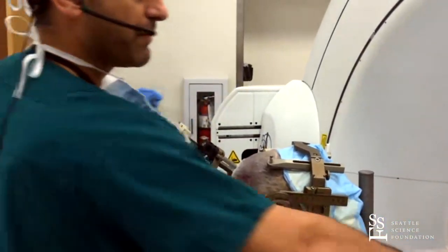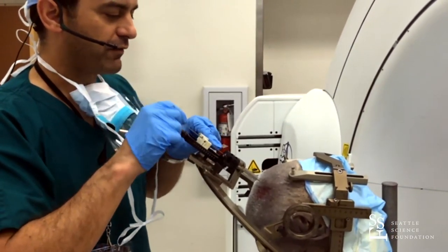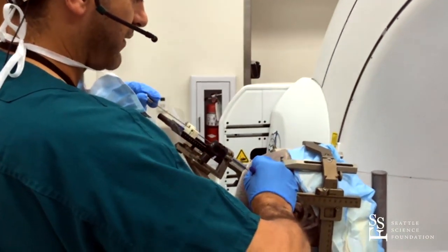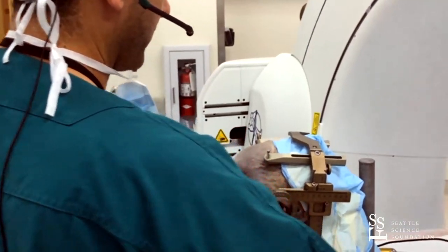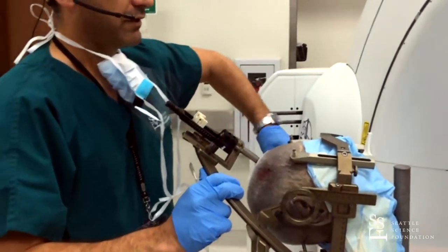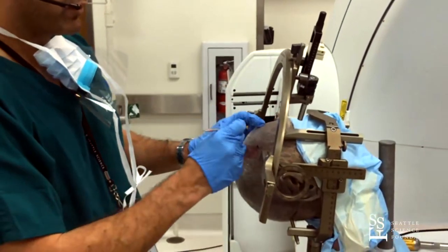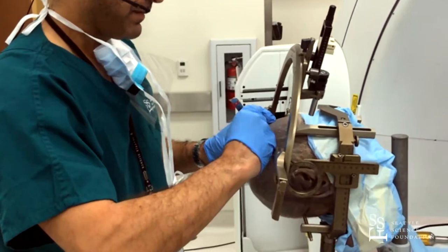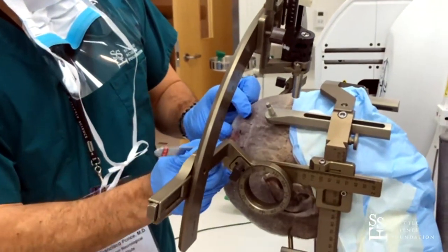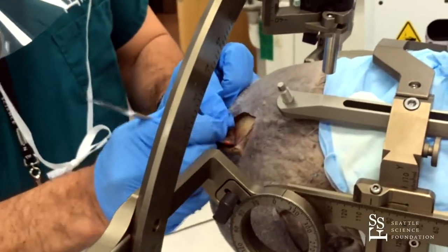Once we have this position, we can use it to identify our entry point, because we've selected our entry point carefully to avoid critical structures. We don't want to shortchange ourselves by changing that entry point. So we mark that spot, and then we can plan our incision.